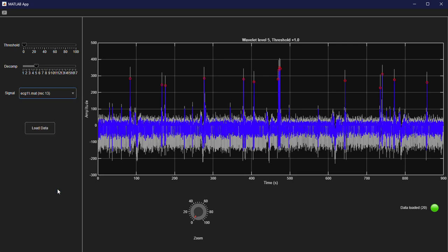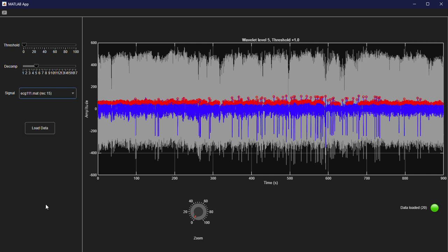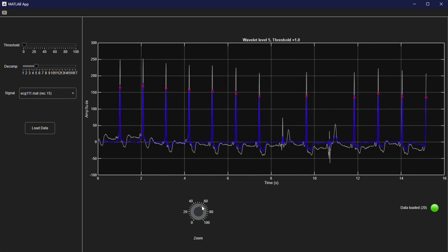overlay with the purple post-filtered signal, and the red marks are the peaks, the QRS peaks. So we can zoom in. Zooming in, we can see the QRS complex and the R peak detected.